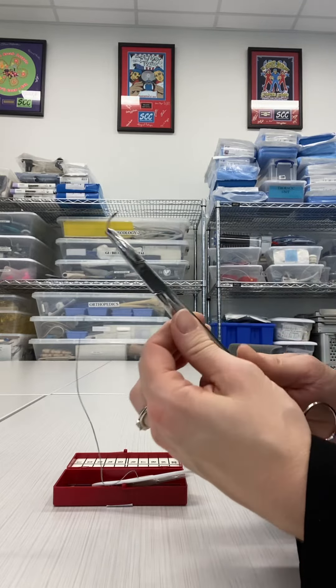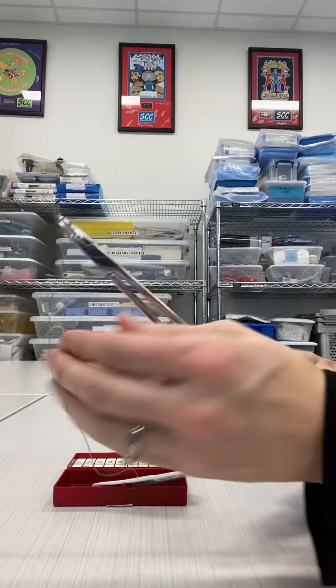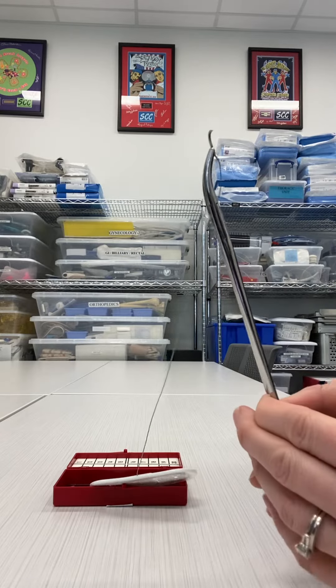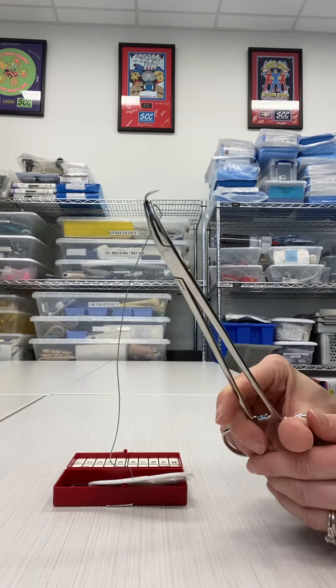The angle of this needle will depend on where the surgeon is using it. If they are at the vaginal cuff, inside the vaginal canal, they may want this very, very angled, so it is almost like a straight line. If they are more superficial, they probably won't want as much angle.